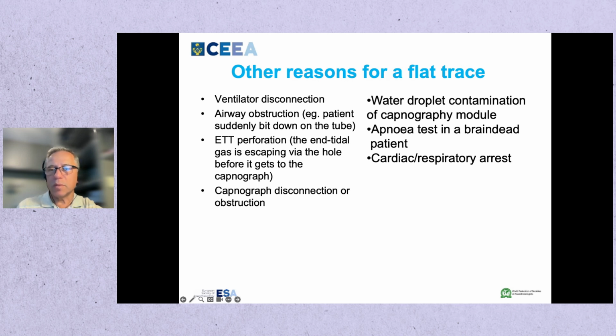It would probably be important to qualify that last point. It will probably be important to explain a little bit more about cardiorespiratory arrest. The end tidal CO2 waveform in cardiac arrest would only be flat if the heart has stopped and you are not doing anything about it.